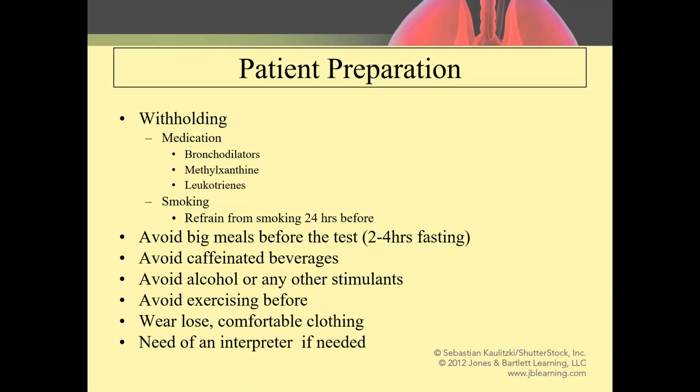But the idea is that smoking is an irritant. If you took 1,000 patients who happen to be smokers and they had a cigarette or two before the testing was done, their results would tend to be a little bit worse than somebody who hadn't smoked in 24 hours, with the mindset that the smoke is an irritant. Avoid big meals, avoid caffeinated beverages. I kind of alluded to that with the methylxanthine conversation.